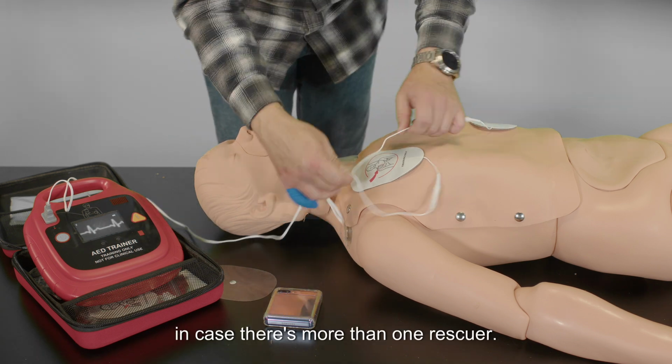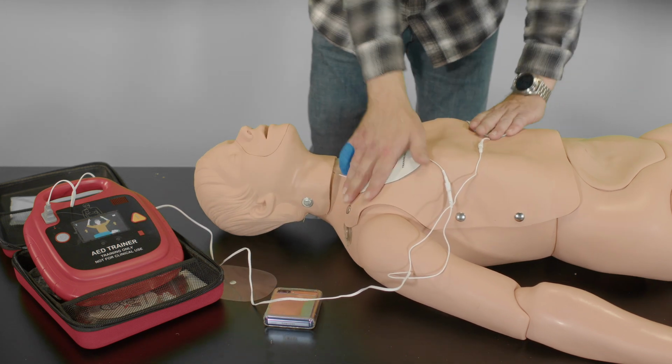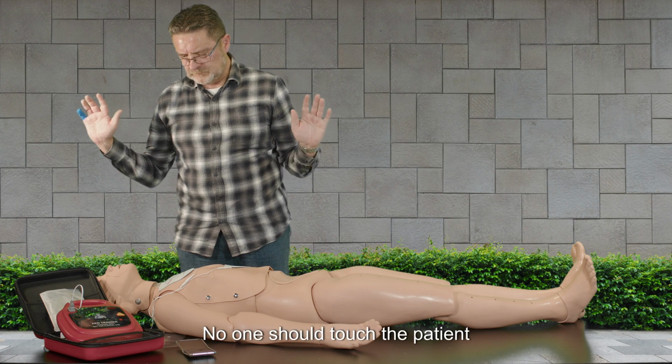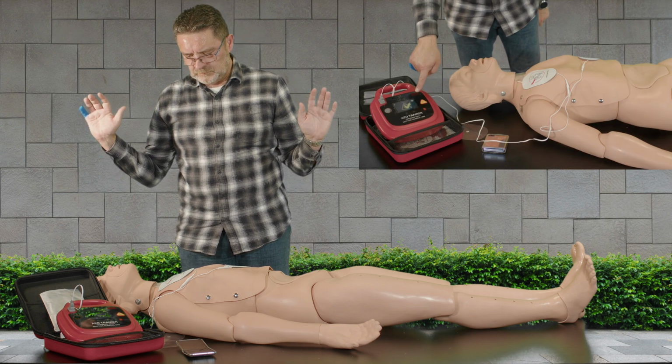In case there is more than one rescuer, do not interrupt the CPR. Keep the area clear and manage the shock. No one should touch the patient during the analysis or during the shock.